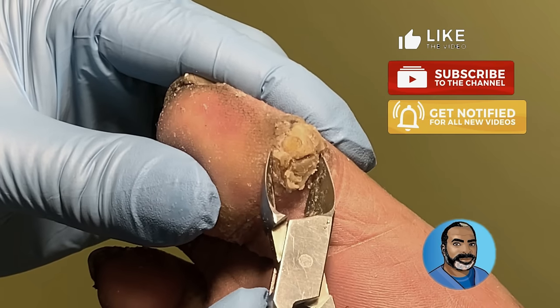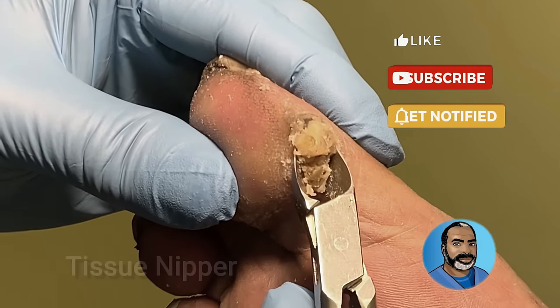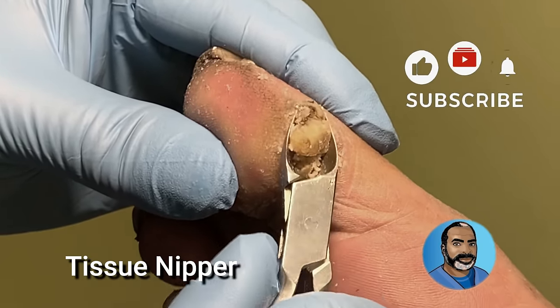The callus was so thick and hard on this patient that the blade was unable to pass through it. So I had to use a tissue nipper first to clip off as much of it as I could, just like trimming a toenail.